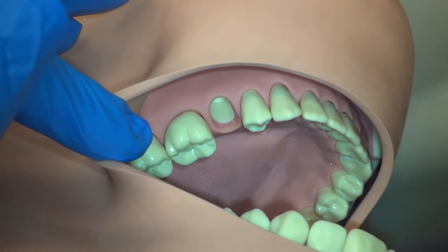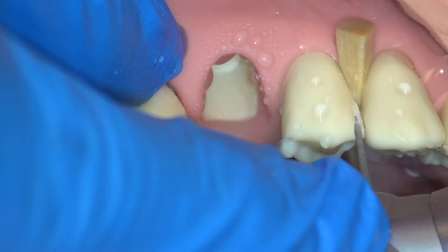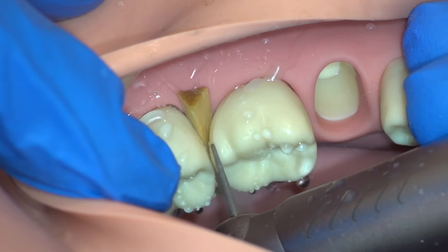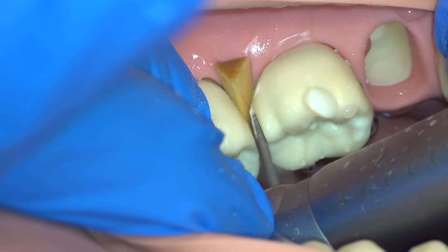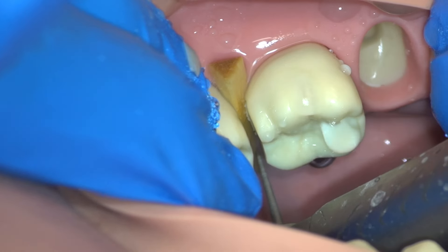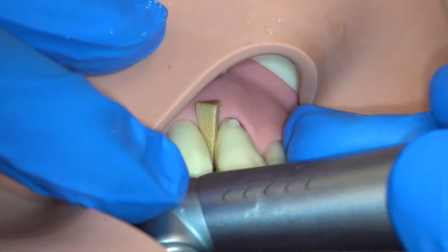We will now begin our preparation with the interproximal separation from the buccal view. We always utilize our left hand to support the handpiece in the bimanual technique, and a wedge has been added to our premolar and molar so that we can have a little bit of extra leeway space. Note that the interproximal separation is not done all at once, but rather working from coronal to apical, reducing the bulk of tooth structure. This increases cutting efficiency and control.